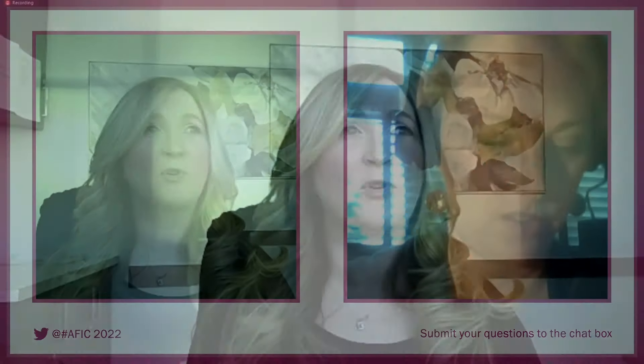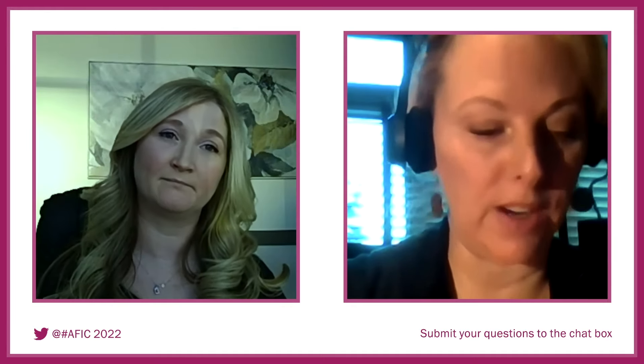Final question: what if you get a two-vessel cord in one picture and a three-vessel cord in another? This requires some problem solving — it depends whether we're talking about at the level of the fetal cord insertion (seeing the bifurcation) or in the cord itself. There are possibilities where part of the cord doesn't show three vessels but the fetal insertion does — this leads to a different diagnosis versus a simple two-vessel cord. If you're seeing it at the cord insertion, track the fetal cord and do a cross-section to show whether there are two or three vessels to prove the finding. Truthfully, you cannot have both a two-vessel and three-vessel cord — one of those images may be suboptimal.